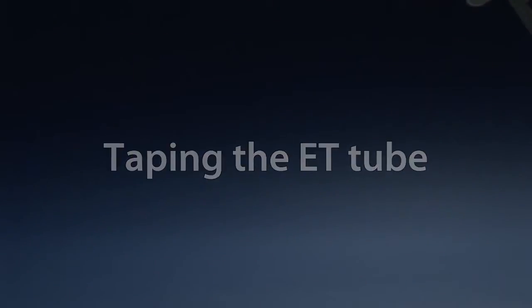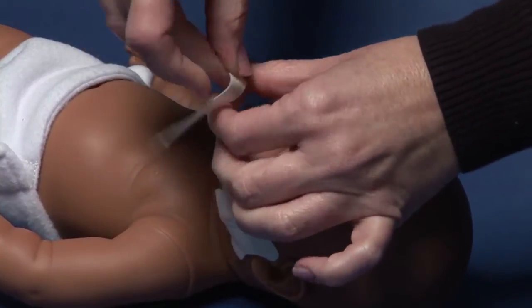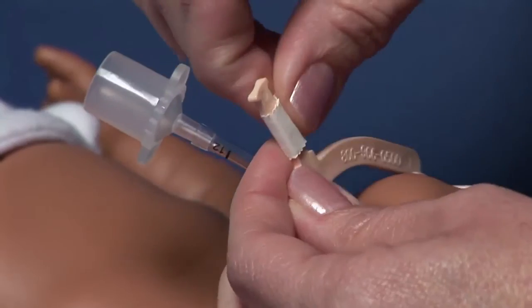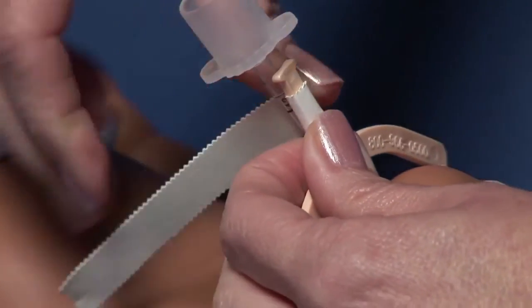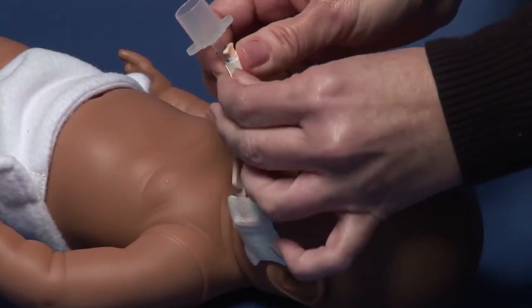To tape the ET tube, use white or cloth tape. Begin by wrapping the tape completely around the platform of the Neobar, then continue taping around both the platform and the ET tube. Leave a small courtesy tab to facilitate re-wrapping.